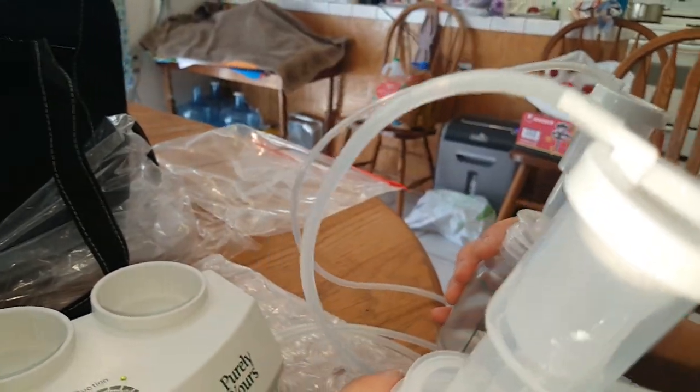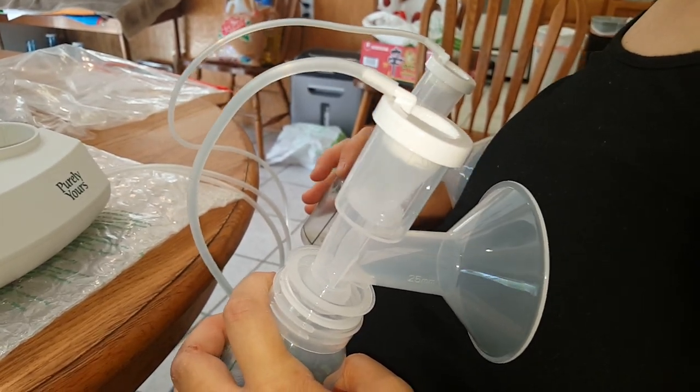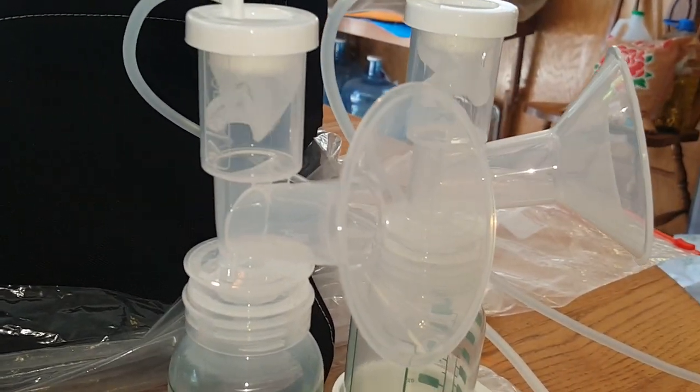And then you'll just put them like that. I can express usually about four ounces each side per pumping. So that's how it works.